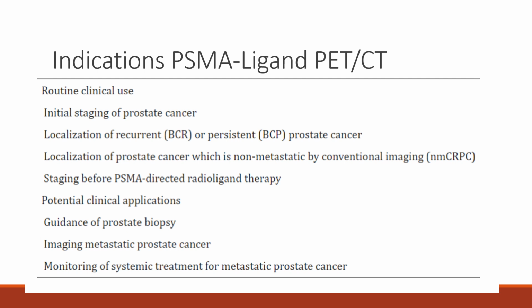Localization of recurrent or persistent prostate cancer, localization of prostate cancer which is non-metastatic by conventional imaging, staging before PSMA directed therapy. So this is done before therapy to make sure it's still PSMA avid tumors and to kind of plan the treatment. Potential clinical applications are like guidance of the therapy or guidance of biopsy, imaging metastatic prostate cancer, monitoring of systemic treatment.